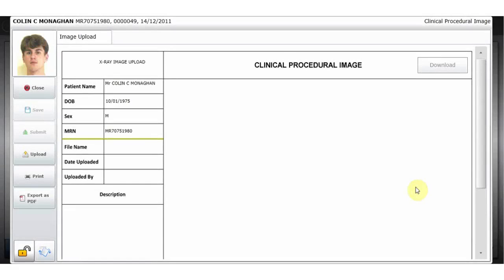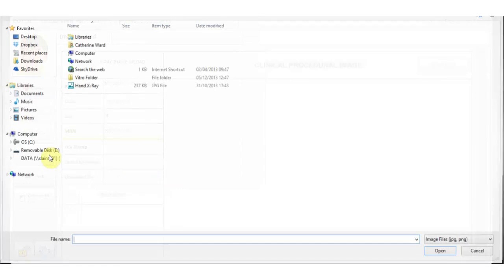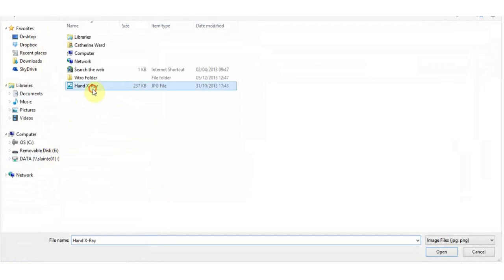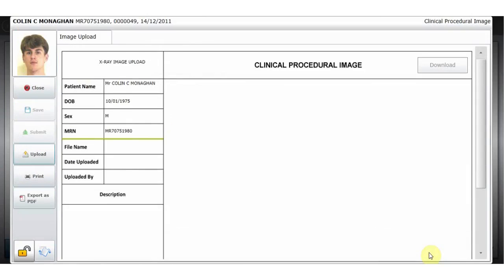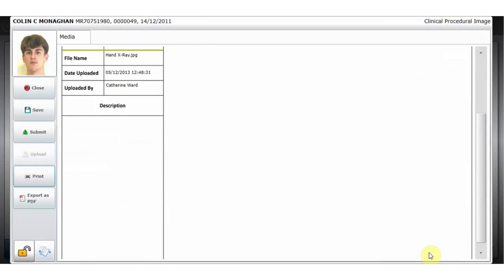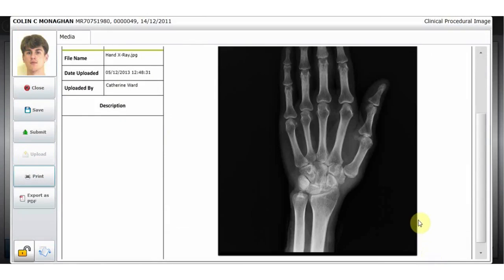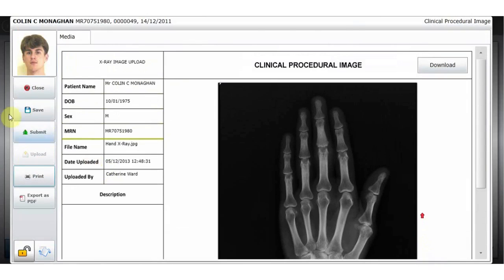This form demonstrates how files and folders can be uploaded to Vitro. To upload images to the application server, click upload and select the file you wish to upload. The image, in this case a hand x-ray, can be seen and saved to be a part of the patient chart book.